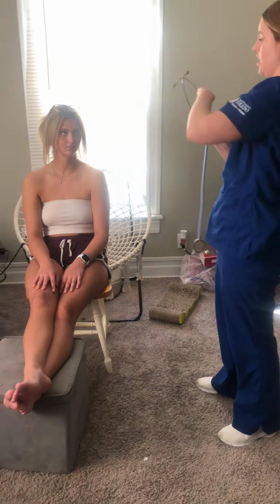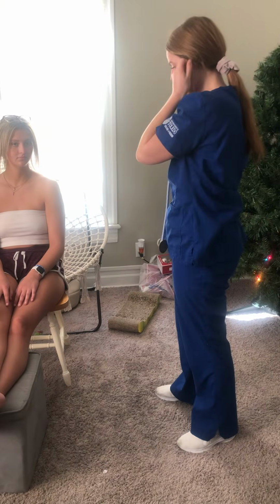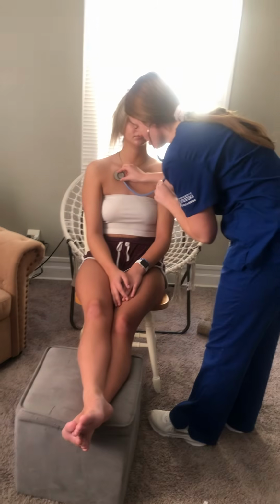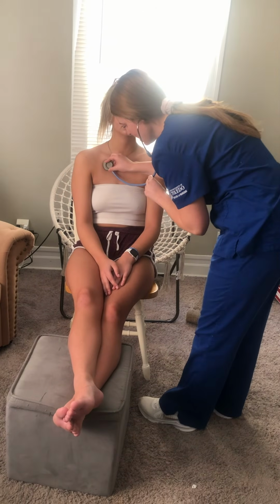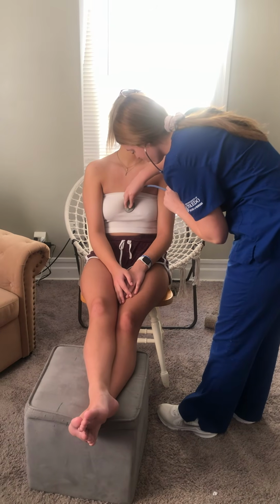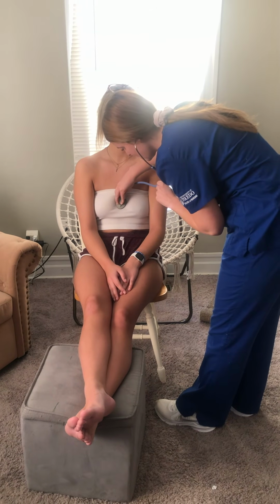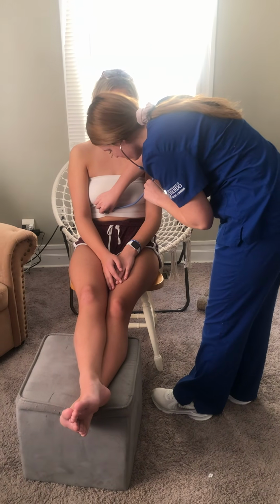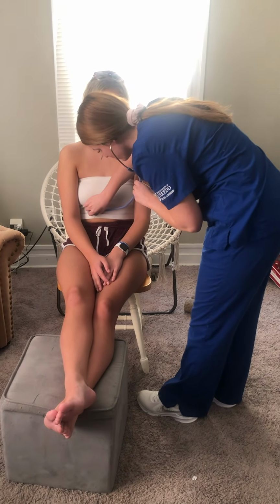So the first area I'm going to start is right below her trachea. So right here we're going to hear bronchial sounds, and then we are going to move more towards her sternum. And here we are going to hear bronchovesicular sounds, and then we're going to move more towards the bottom of the lungs. And there we are going to hear vesicular sounds.